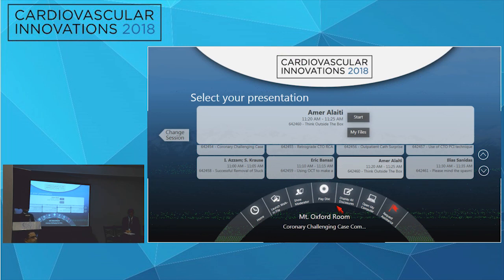So the presentation of this patient was ACS, was it? Yes, the last one she presented with was ACS. The reason you put in a stent was ACS? Yes, because this time she had an NSTEMI, LV wall motion abnormality, and EKG changes, everything was consistent with it, and the FFR was 0.5. We were trying to avoid doing any intervention, but we couldn't.